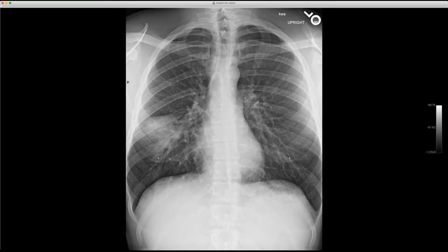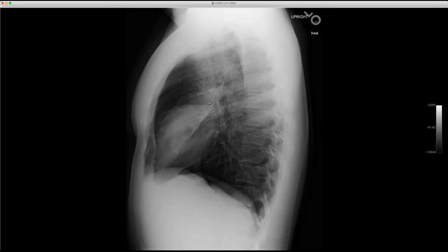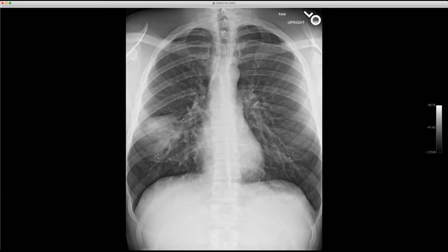So this is a young guy who presented with fever and cough and didn't respond to conventional therapy. You can see he's got an area of consolidation in the middle lobe, nice middle lobe area here. No pleural effusion, and of course a little bit of volume loss. One of the things we think about around here is fungus, particularly blasto, because histo very uncommonly gives you consolidation. Coxie could look like this too, but he hadn't traveled.